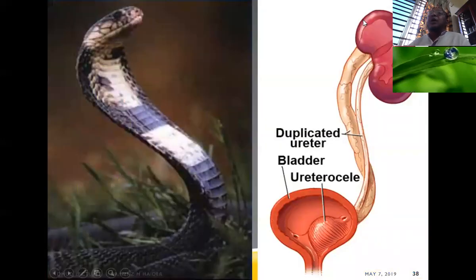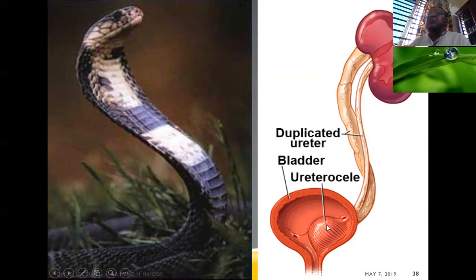On IVP, there is a classic sign associated with ureterocele known as the cobra head sign — the dilated ureter terminal end resembles the head of a cobra.